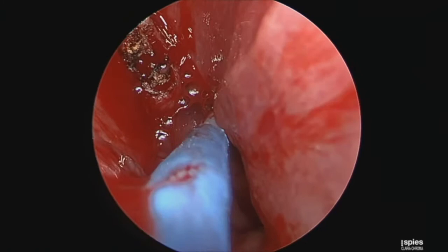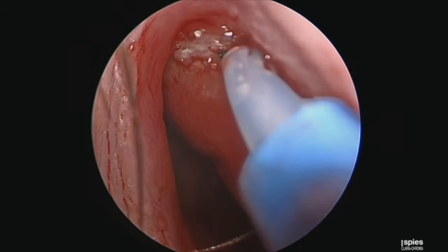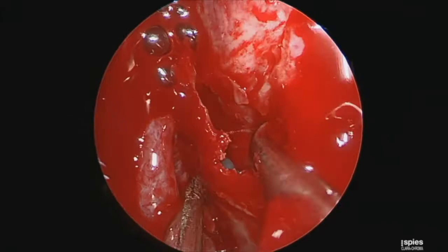Initial exposure consists of resection of the middle turbinate. A free graft would be used on the nasal septum at the end of surgery. A right-sided vascularized nasal septal flap is performed. Here you see the first inferior cut, now the superior cut, made superiorly at the level of the middle turbinate, extending as high as possible anteriorly, where we are anterior to the olfactory mucosa.